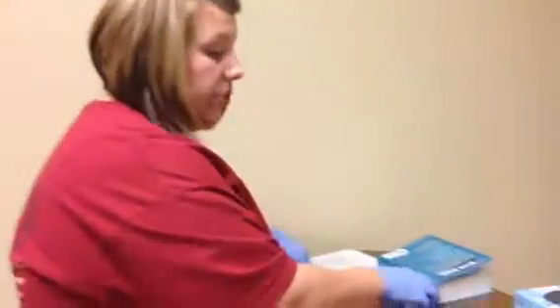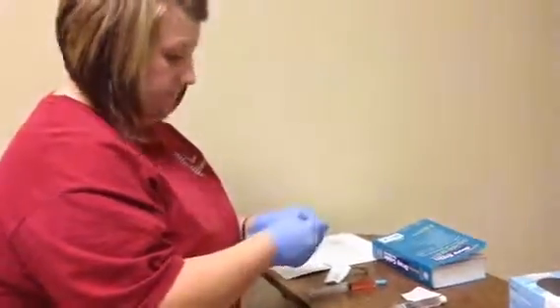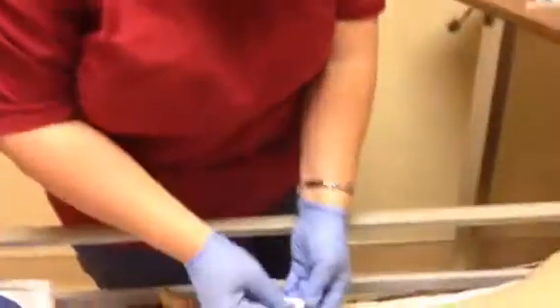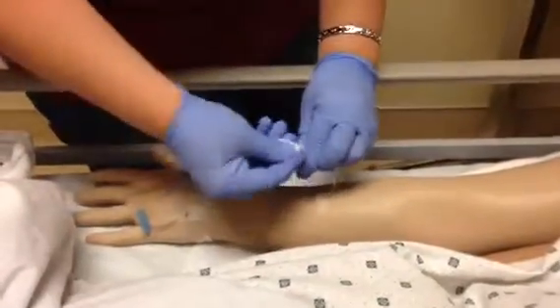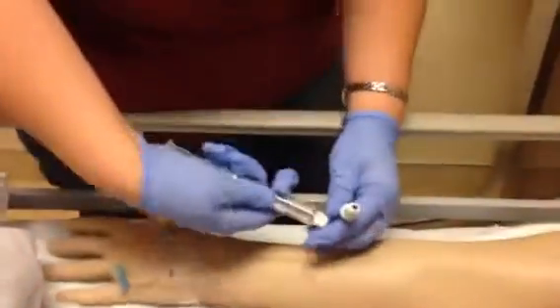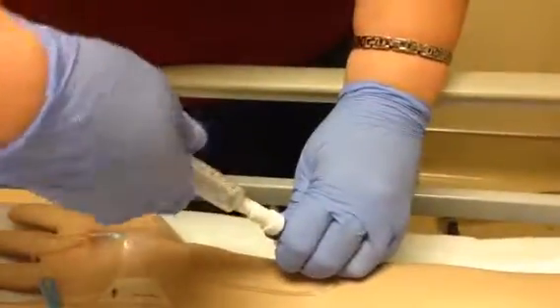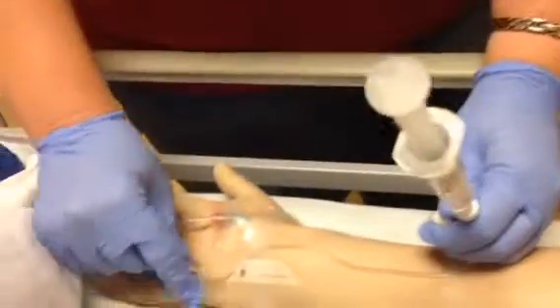Okay, so Mr. Dunn, we're getting ready to administer your medication. The first thing I'm going to do is swab the alcohol. I'm going to get my saline syringe. I've got to unclamp.